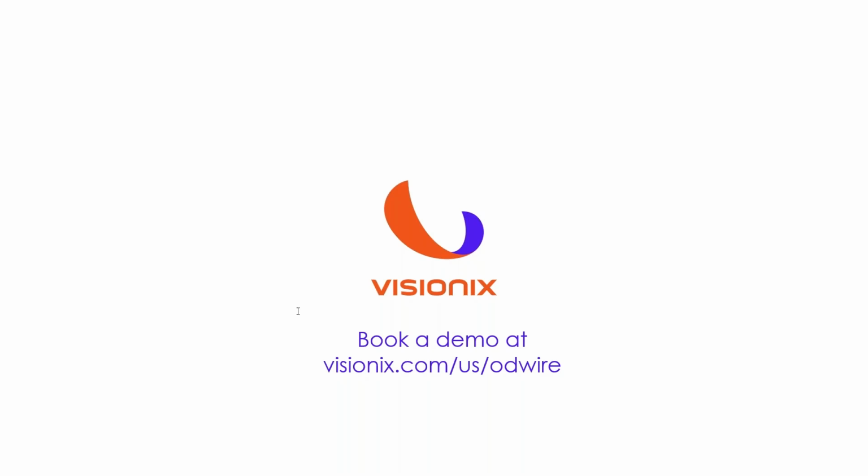Does OCT-A have diagnostic application in ocular ischemic syndrome, since the lesions are in the mid-periphery? Yeah, that's a tricky one because now you have to get really, really far out. Even though this technology will go up to about a 12 by 12, you can do a montage. I'm thinking as I speak.